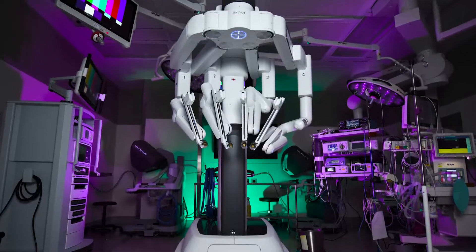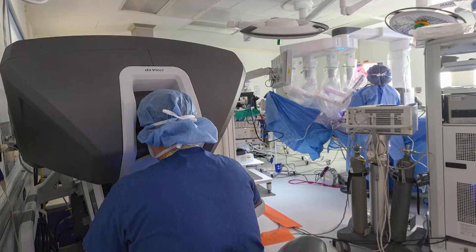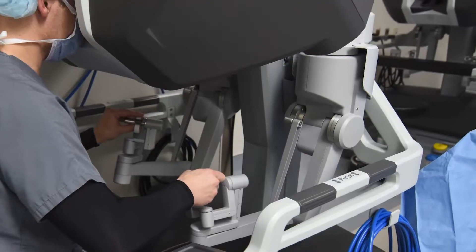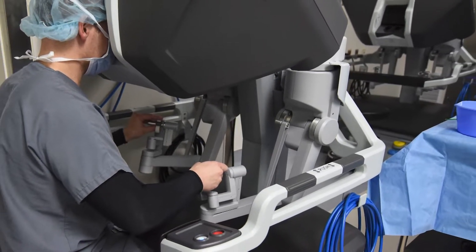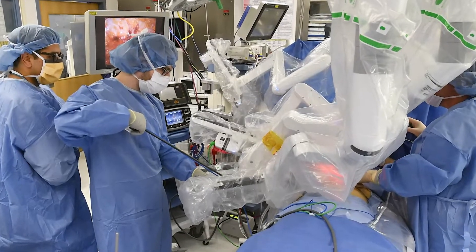Current robotic surgical systems have a large footprint, making them impractical for use outside an operating theater. Also, these devices are far from autonomous and require an experienced surgeon to control the interaction of the robot with the patient.